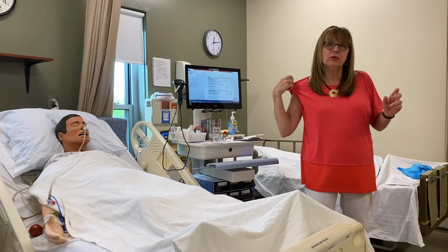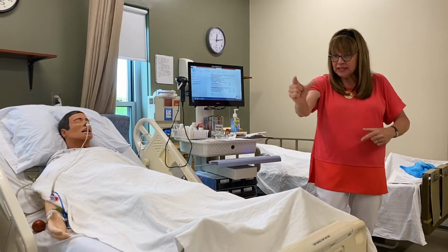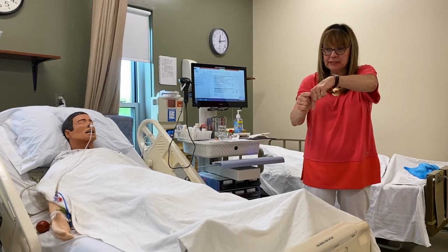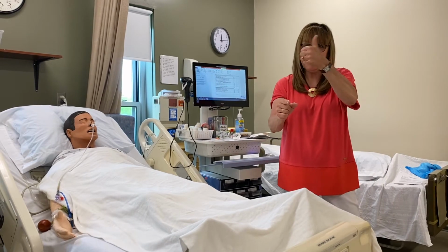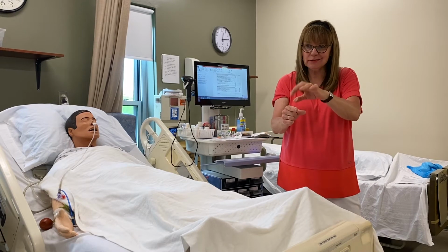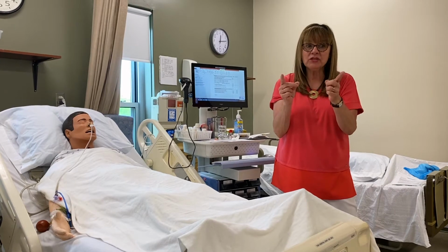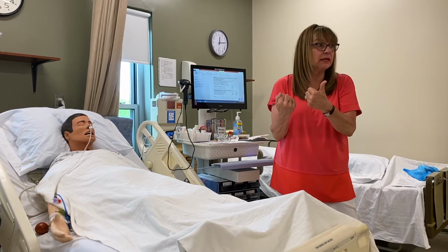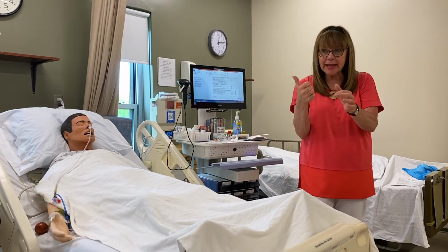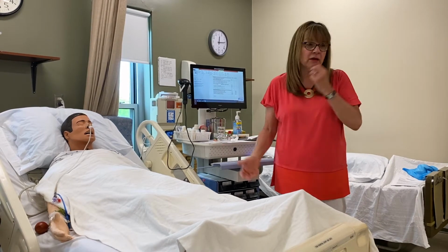The other rule for IM injections is you're going to spread the tissue when the needle goes in so that you can get it deep into the muscle. You're going to aspirate, pull back on the plunger to make sure that the medication is not in the vein. Because if it's in the vein, you're giving way too large of a dose, IM, and it would cause an adverse effect. So if you pull back and you get blood in your syringe, it indicates you're in a vein and you're going to throw that out and start again.